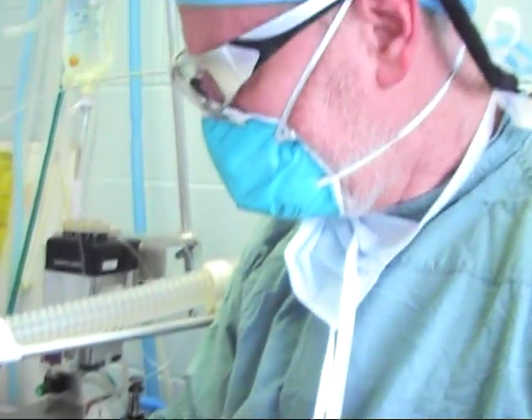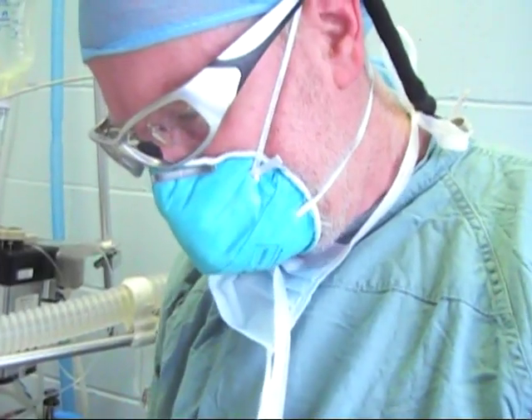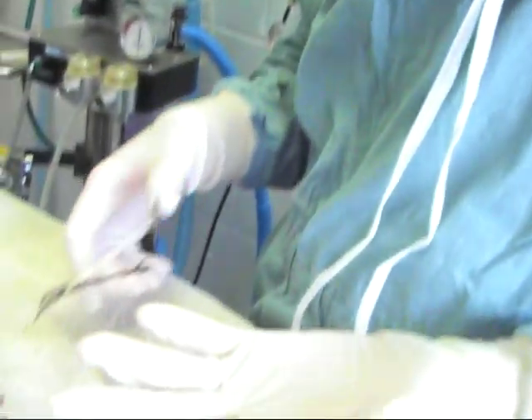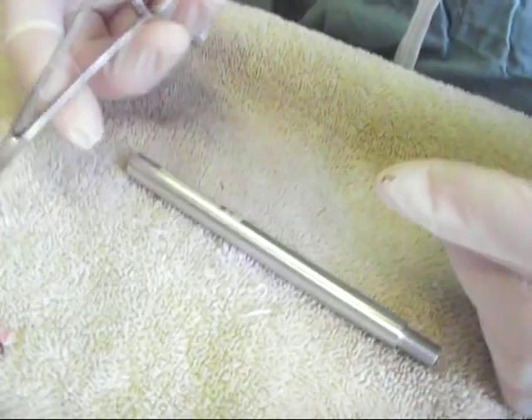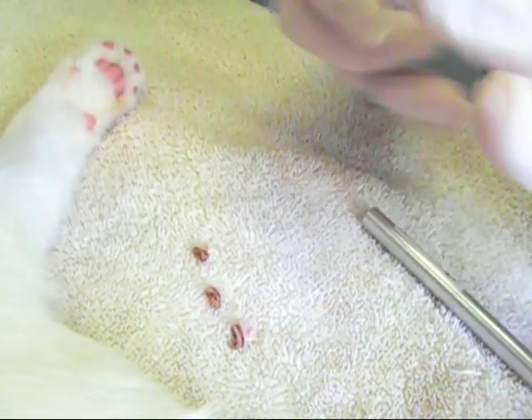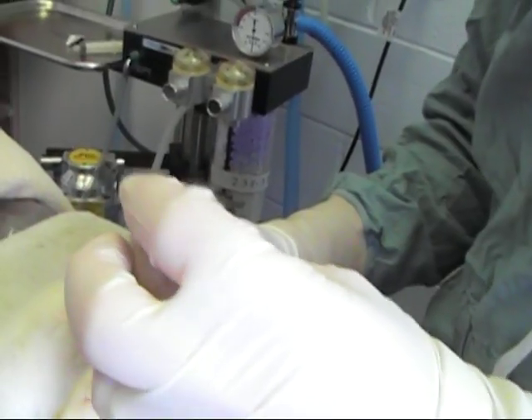Why is the laser preferred over the old cut-and-stitch method? The biggest reason I'm most excited about is blood loss — there's virtually no blood loss. I've done three nails so far. We don't have a tourniquet on the legs, and there's no bleeding. I don't have one drop of blood in my gloves. And so that's a huge plus for these kitties.